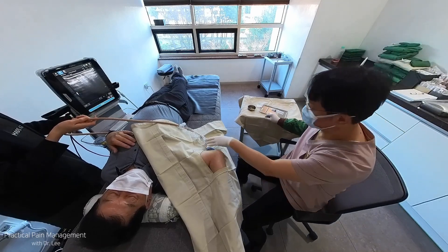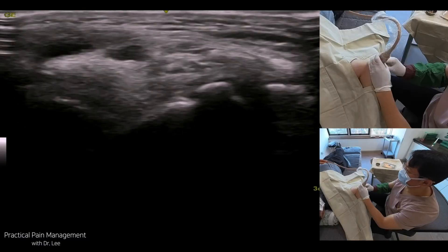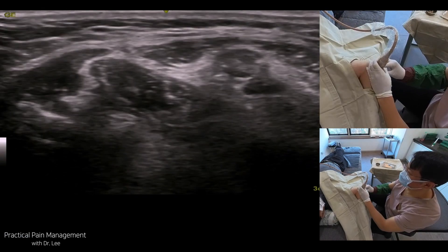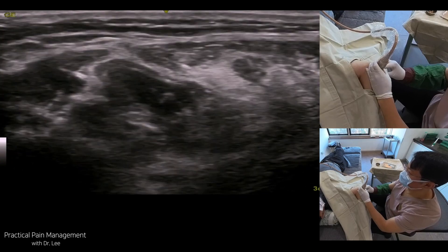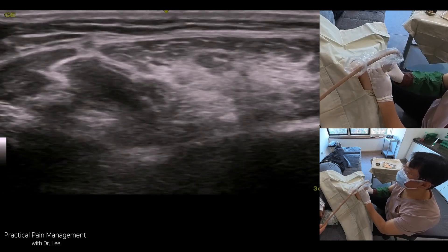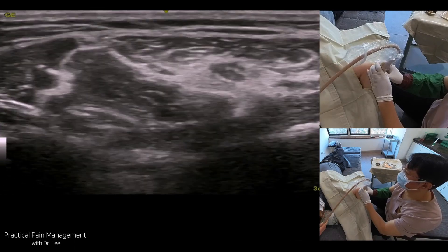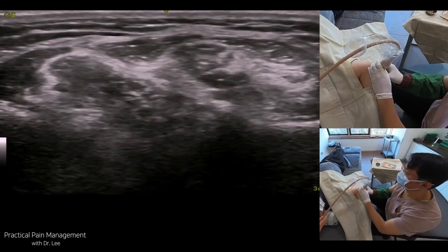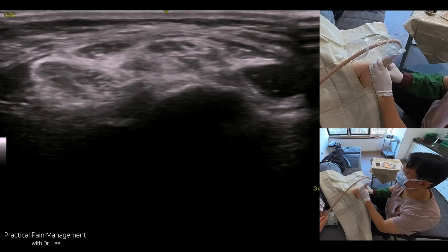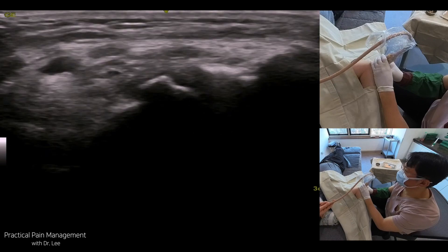Second, use the motorized table and elevate it until the elbow is at the operator's face level — this allows a posterior approach to the ulnar nerve. Third, use a 1-inch needle. Under ultrasound guidance, insert the needle in-plane, approaching from medial to lateral using a 26-gauge 1-inch needle. A longer needle is more challenging due to the short travel distance from the medial skin. Fourth, hydrodissect the nerve for the whole length of the cubital tunnel. Find the honeycomb-shaped ulnar nerve in the medial epicondylar area and trace the nerve proximally and distally. Fifth, find the underlying pathology.